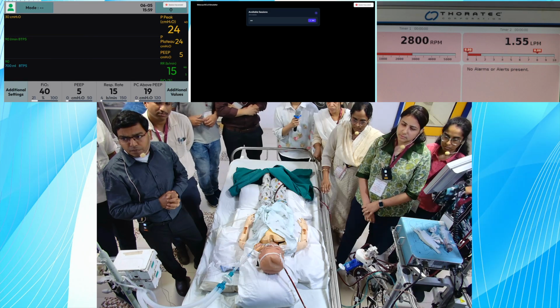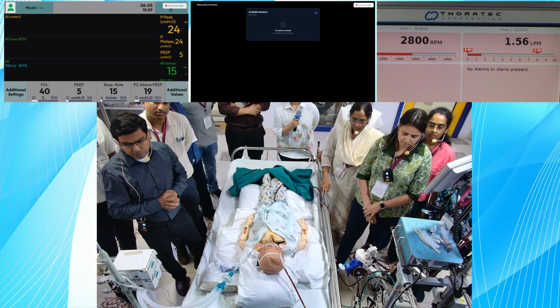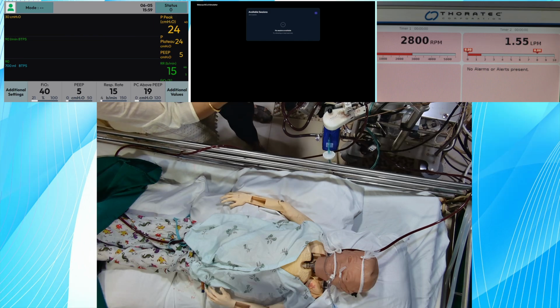And post oxygenator pH is around 7.28, PO2 is around 45, PCO2 is 56, bicarb 20. So the problem is with the oxygenator. Failure of the oxygenator or the blender. So we'll first change it to the oxygen cylinder.